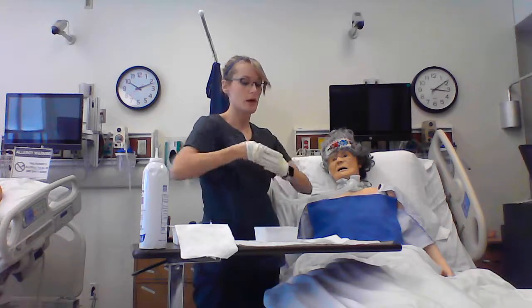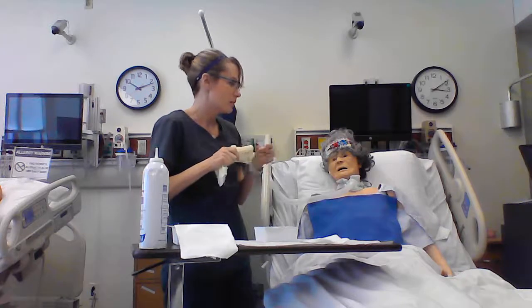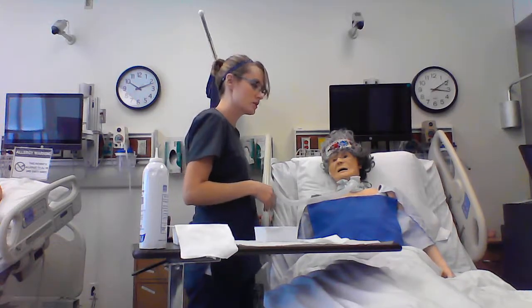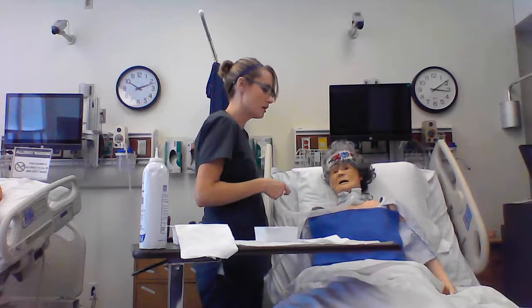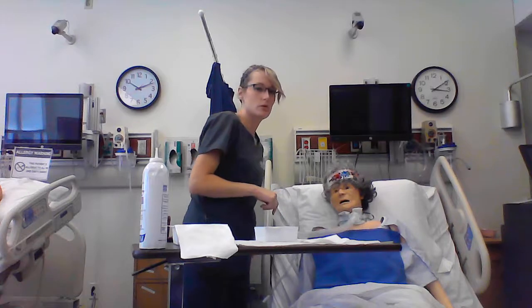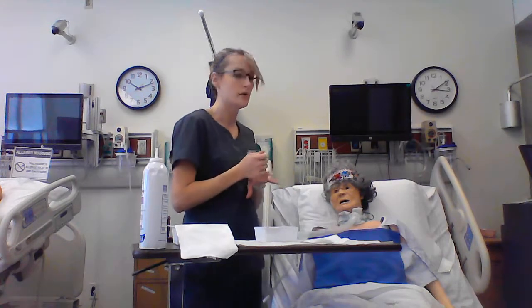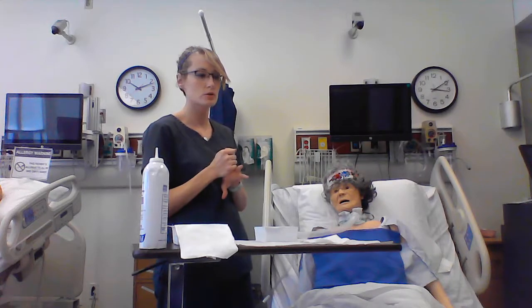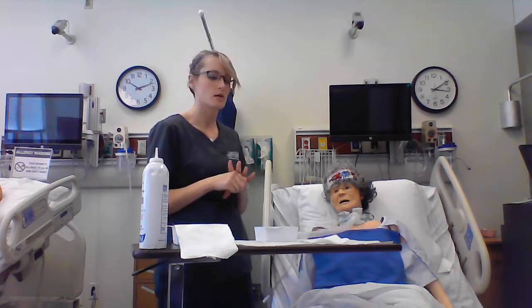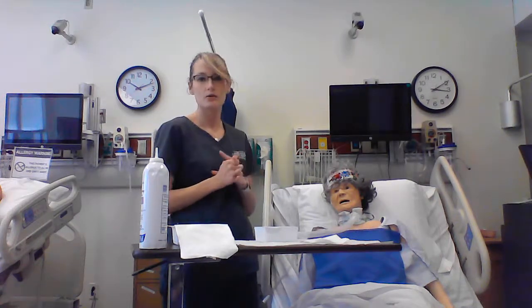I need to clean up my area here, clean up my mess. I would want to lower Miss Opal back down to earth. Make sure she's got a call light in reach and her personal belongings in reach. And then you want to go document your assessment. You want to document the amount and characteristics of the secretions that you got out. And then that you changed her trach dressing and the date and time, obviously, that you changed that. And that should be all.